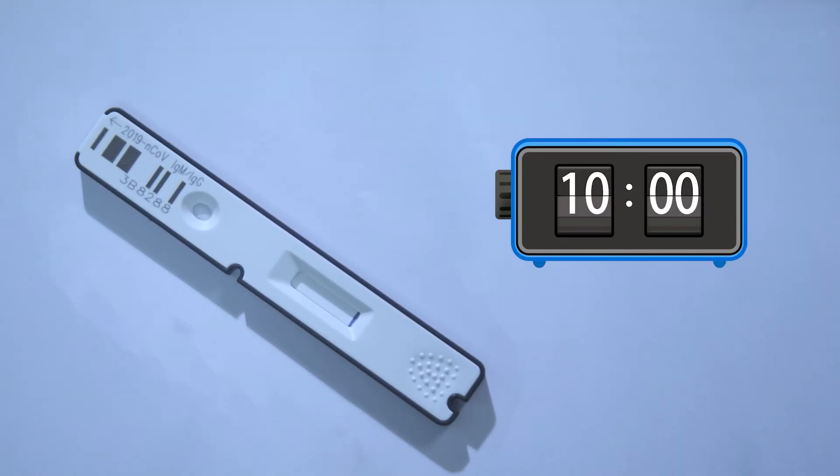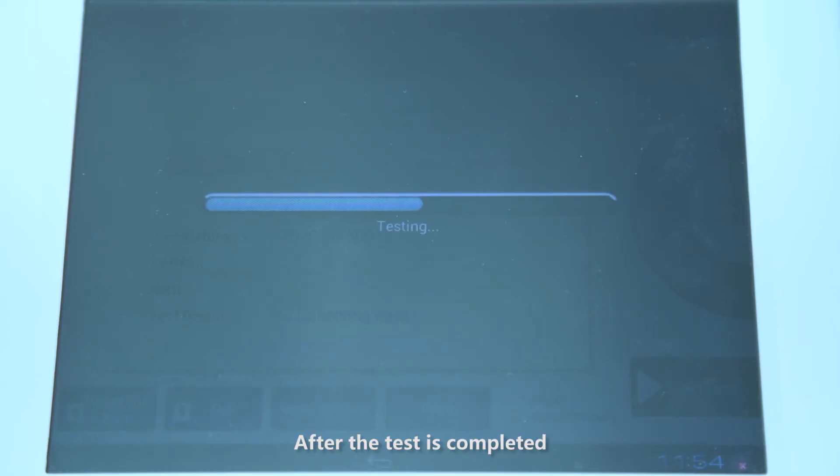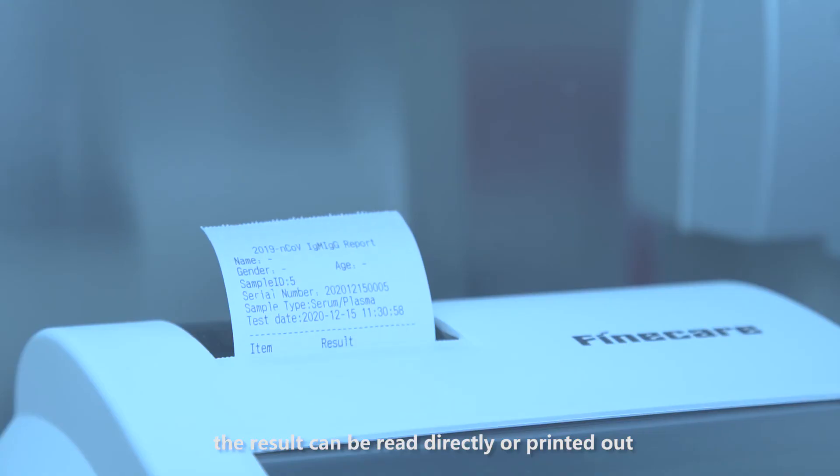After 10 minutes incubation, insert the test cassette into the device tray. Press start to run the test. After the test is completed, the result can be read directly or printed out.